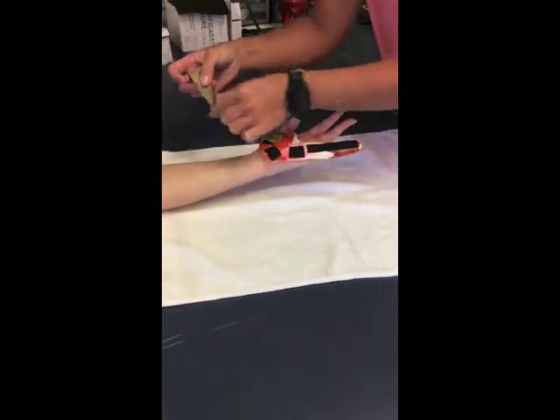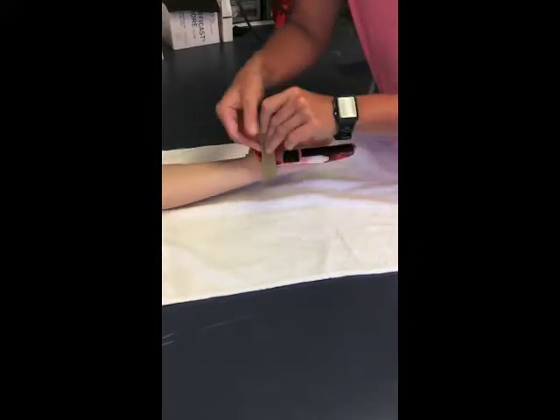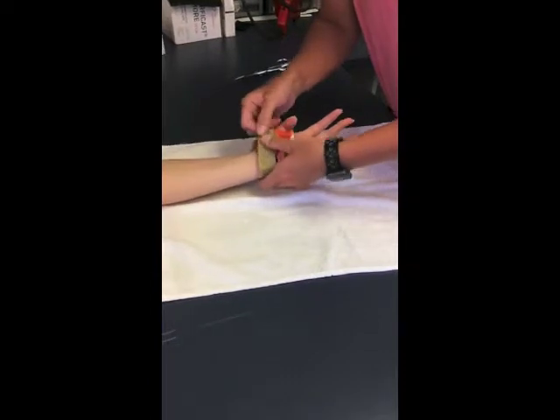I made little strips here so it's a little bit more comfortable when the patient goes into flexion and extension of the wrist, so this doesn't scratch up against her.